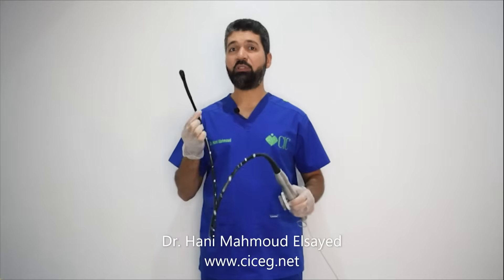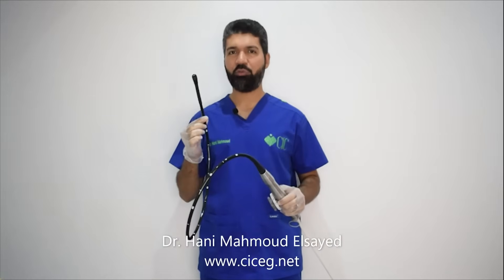Welcome everybody. In this presentation, I will tell you the tips and tricks on how to manipulate the transesophageal echocardiography probe.